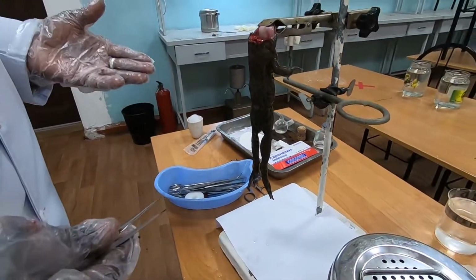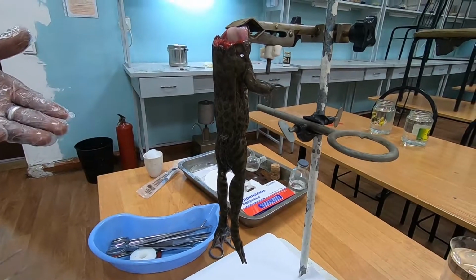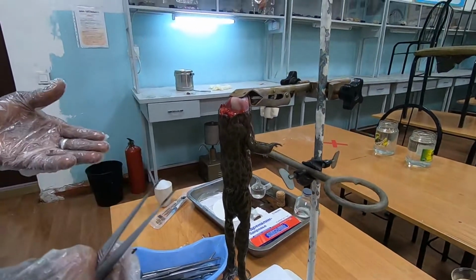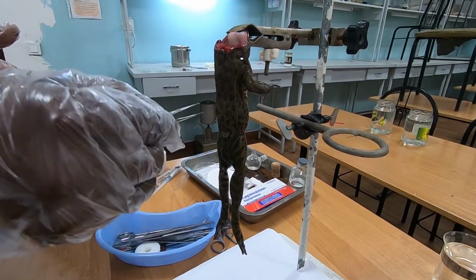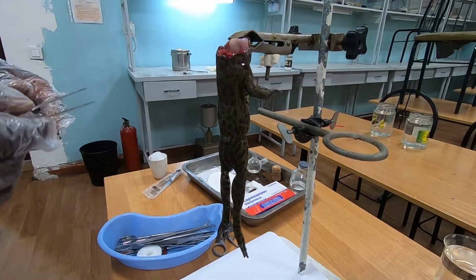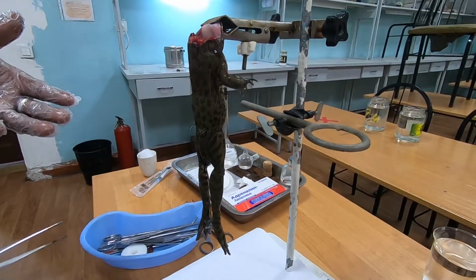Now we're going to see what will happen, to know that the frog is not yet dead. So we're going to use this our forceps to pinch different parts of the body, to see the reflex reaction we're going to get.